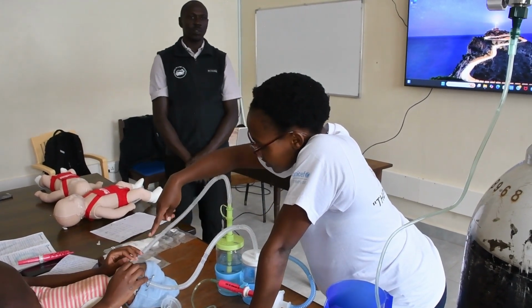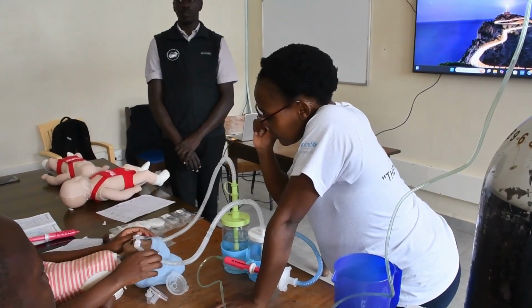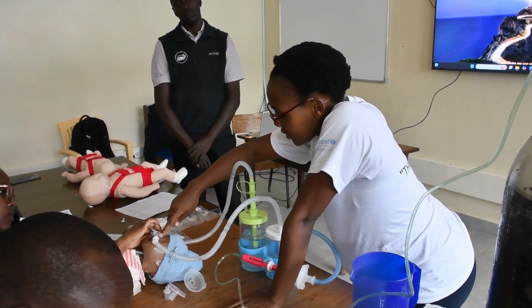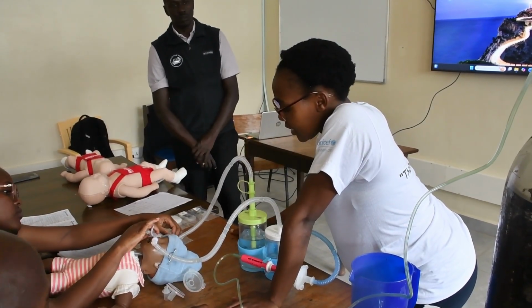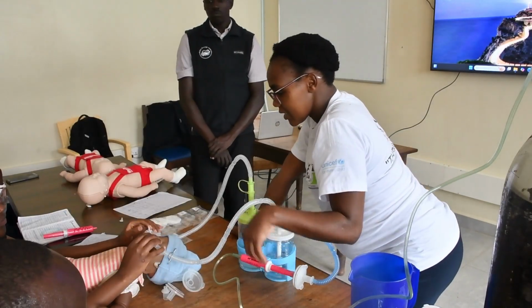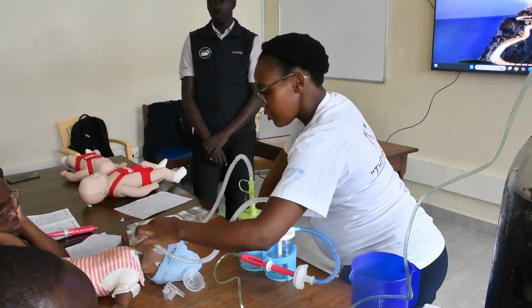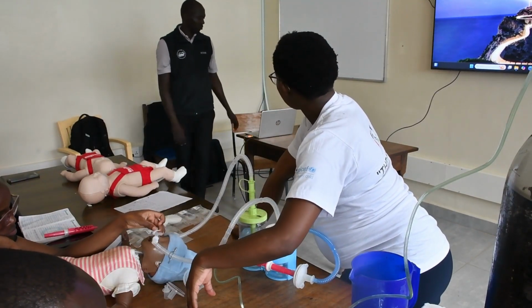There should be no whitening at the nostrils, on the upper part of the nose. That shows that there's some pressure there. And then you should ensure that there's no moisture around the nasal region.